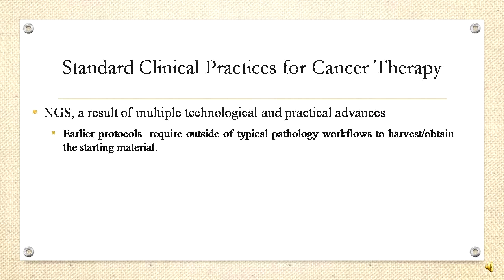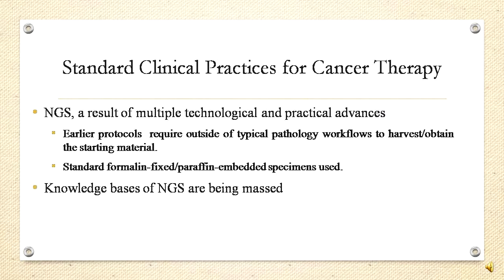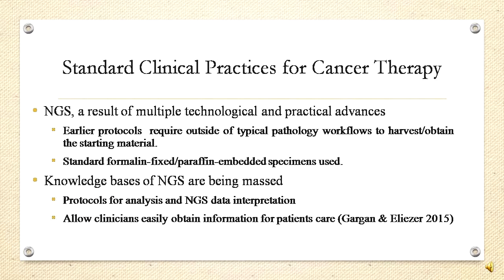Now, NGS uses standard formalin-fixed, paraffin-embedded specimens as the starting material. The knowledge base of NGS is also shared, which means that not only you will be doing NGS, other clinics will be using it as well. Protocols for analysis and NGS data interpretation will allow a clinician to easily obtain information for patient care.